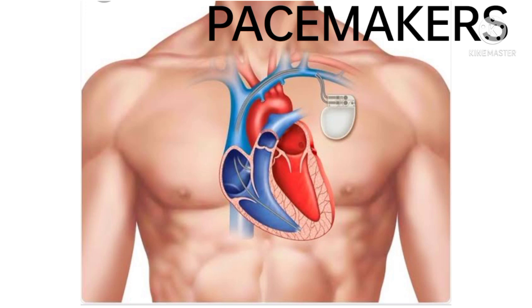Definition: A pacemaker is an electronic device used to pace the heart when the normal conduction pathway is damaged or diseased. A pacemaker is a battery-operated generator that initiates and controls electrical stimulation of the heart via an electrode that is usually in direct contact with the myocardium. A pacemaker is an electronic device that provides electrical signals to stimulate the heart muscle.